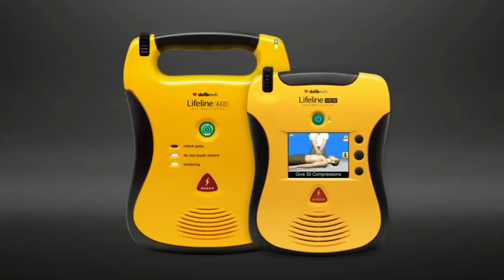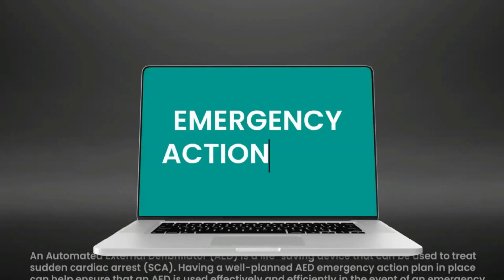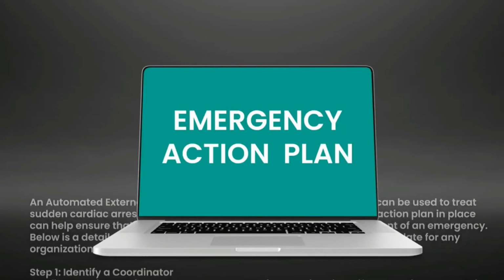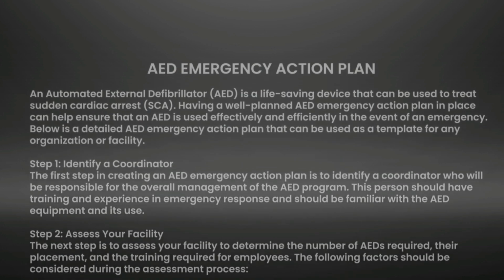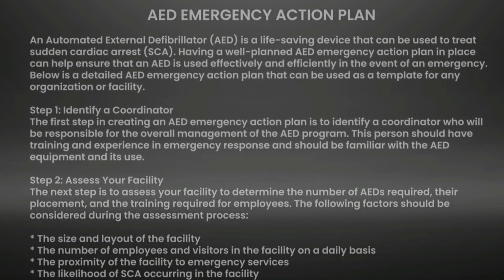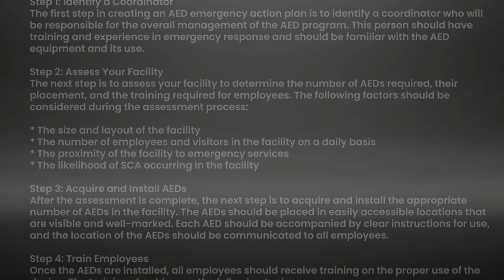Purchasing an AED is a great first step. We always want to make sure we have a complete AED program so we are always ready to help save a life. That starts with an emergency action plan. An emergency action plan is a written plan that documents exact emergency action when sudden cardiac arrest occurs. This plan should be practiced often and reviewed amongst everyone within your organization.